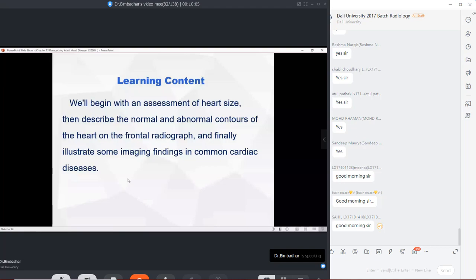Okay, if you are trying to look for only pulmonary status, yes, the modality that is the gold standard in the present day is a CT scan. All right, CT scan is much more superior than a chest radiograph.